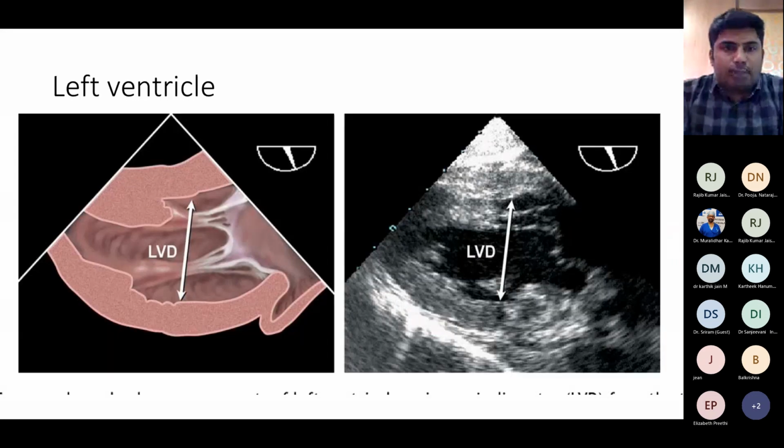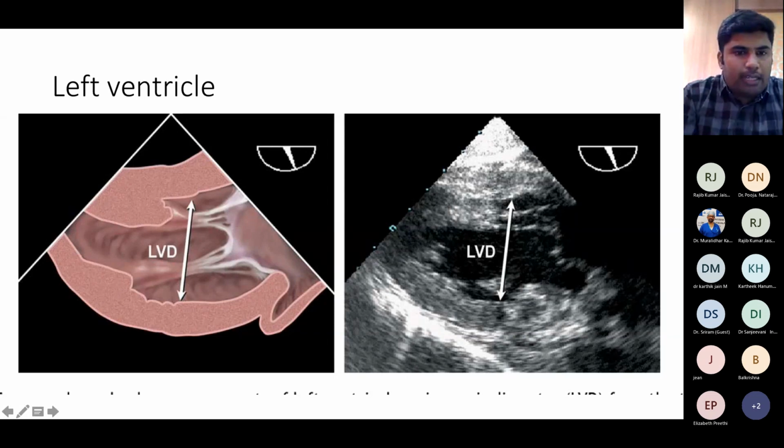First, for quantifying the left ventricle, it is advised to take transgastric views rather than midesophageal views, because lateral wall dropout is more with the midesophageal views. This is not a problem with the transgastric views. The transgastric two-chamber view is used. Here, the internal diameter of the LV is measured just distal to the tip of the mitral valve, and the caliper should be perpendicular to the LV long axis. It should be measured from the inner edge to the inner edge.